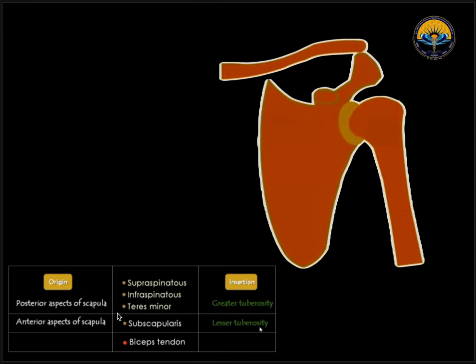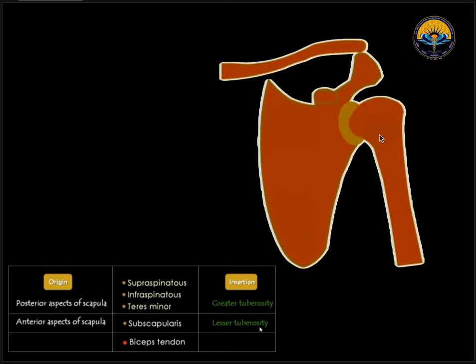Next, coming to the tendons. We have rotator cuff muscles and the biceps tendon. Rotator cuff muscles include supraspinatus, infraspinatus, and teres minor. They arise from the posterior surface of the scapula and insert on the greater tuberosity. Superior to the spinous process, we have the origin of the supraspinatus muscle, which arises and inserts on the greater tuberosity. Inferior to the spine, we have the origin of the infraspinatus, which also inserts on the greater tuberosity. Anterior to the scapula, we have the origin of the subscapularis, which inserts on the lesser tuberosity. Between the lesser and greater tuberosity, we will see the long head of the biceps tendon.